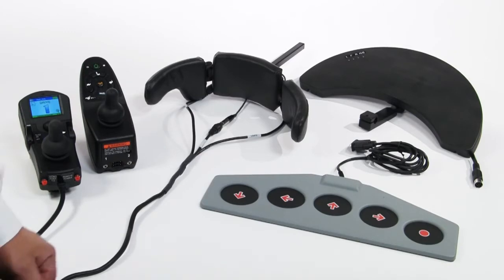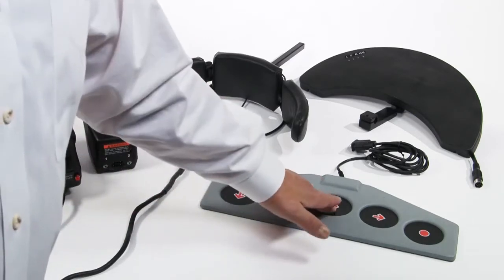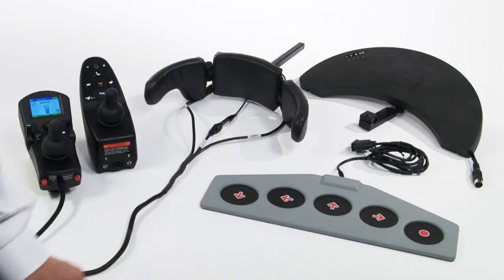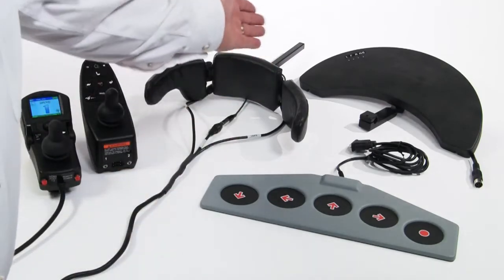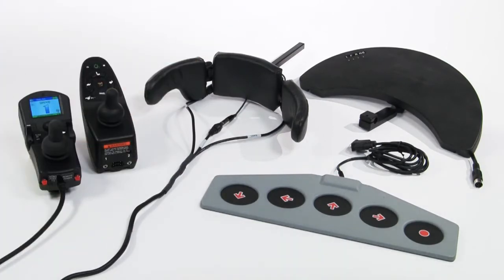A digital driver control is simply a switch, similar to a car horn. It's either on or it's off. Driving in any direction is either on or off when that switch is activated. Typically, there are 4 switches in the system for the 4 directional quadrants: forward, left, right, and reverse. There are ways, though, to drive in 4 directions when you have less than 4 switches. See the video RIM, or 3-quadrant driving, to learn more on this topic.